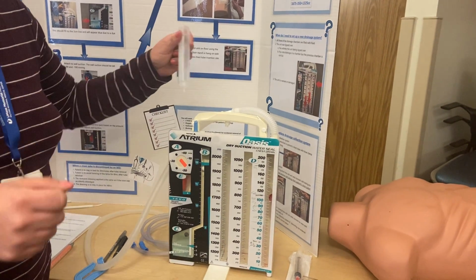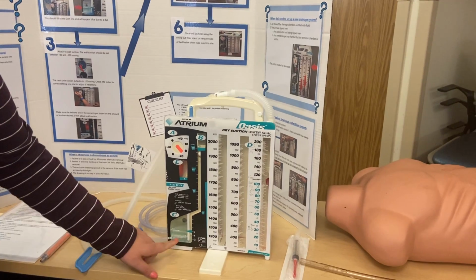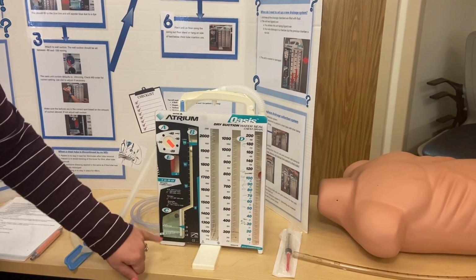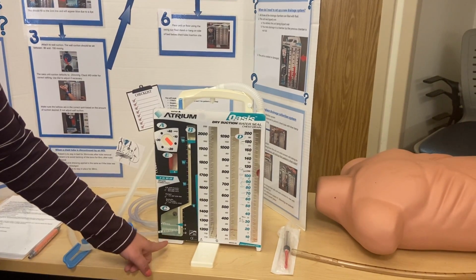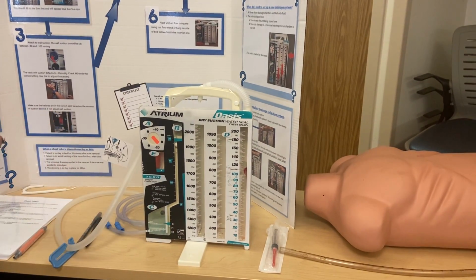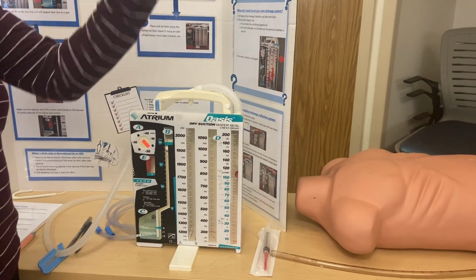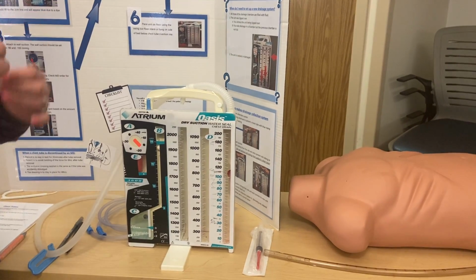Before you even hook up the chest tube, put this water into here, because this water is going to show up in the water seal chamber, and normally it will be a blue color. On this one, you can't really see the color. But the whole point of the water seal is because originally when you had the 3-tube system, you would have the chest tube and you'd want air to escape if it was a pneumo, but you didn't want air to come back into the chest.